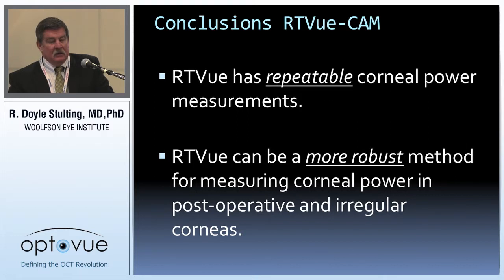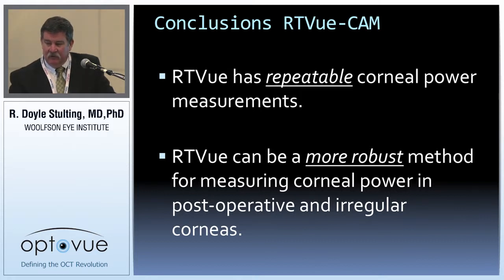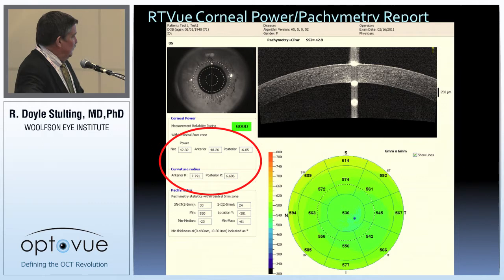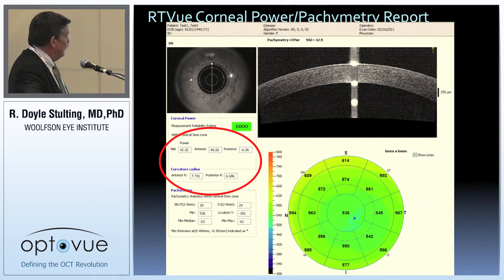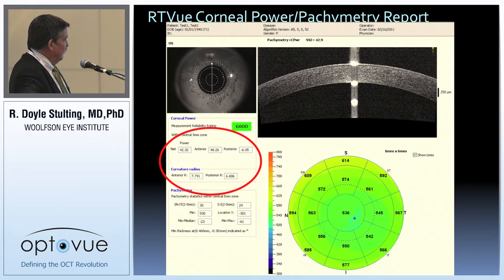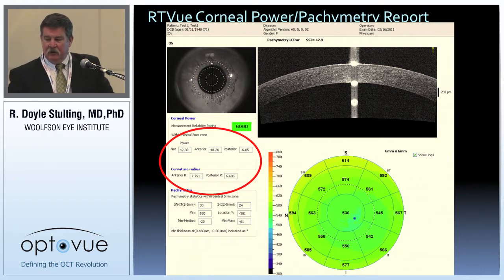The OCT can also measure corneal powers across corneas with irregular astigmatism. Here is the pachymetry report, and here is the anterior and posterior corneal power within the central three millimeters.